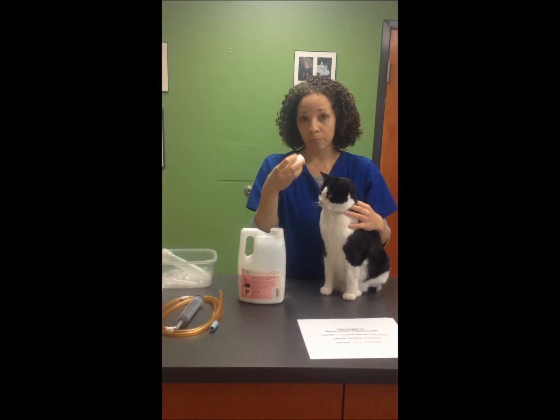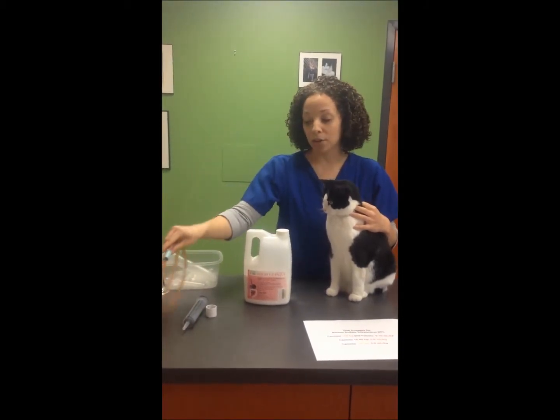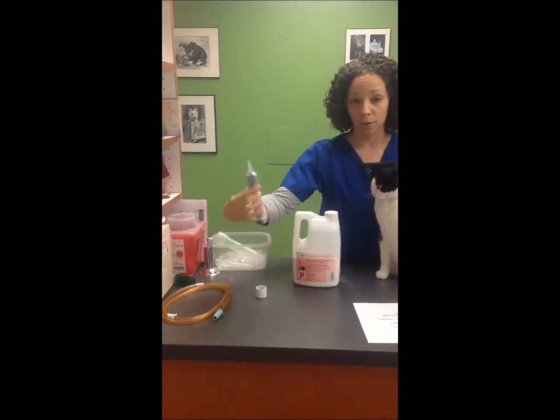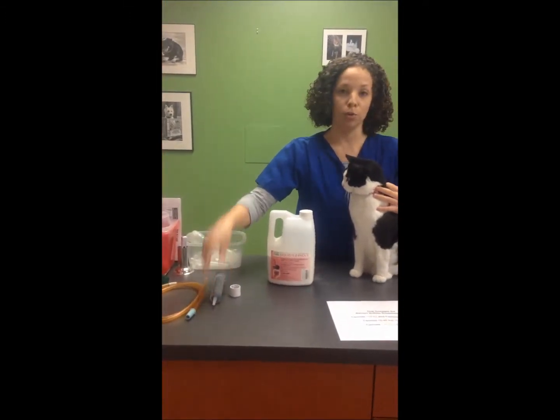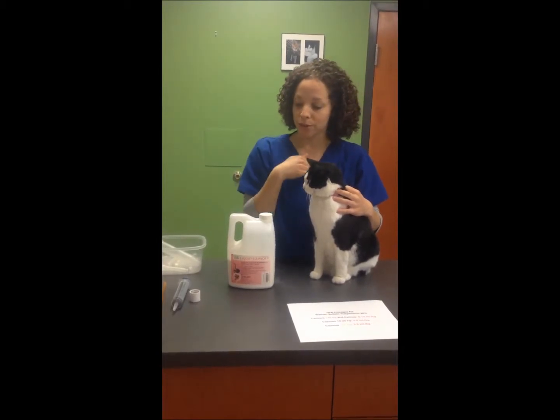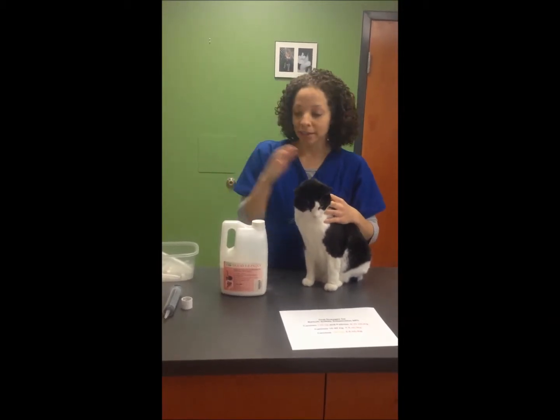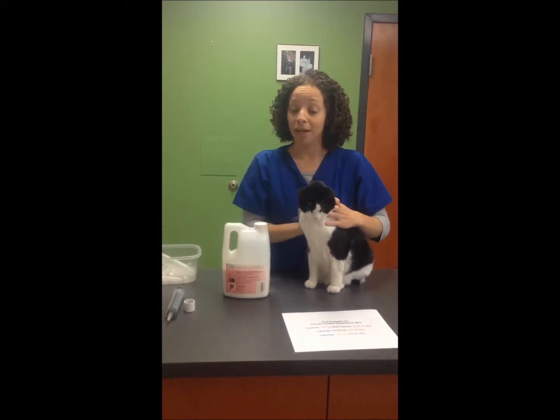We can place this in her mouth, and then we have a gastric tube, through which we can inject the barium from the syringe and try to get it down her esophagus and closer to her stomach. Again, this is another time to keep in mind that not all patients will tolerate this without any kind of sedation, but if you can proceed without using tranquilization, that would be ideal.